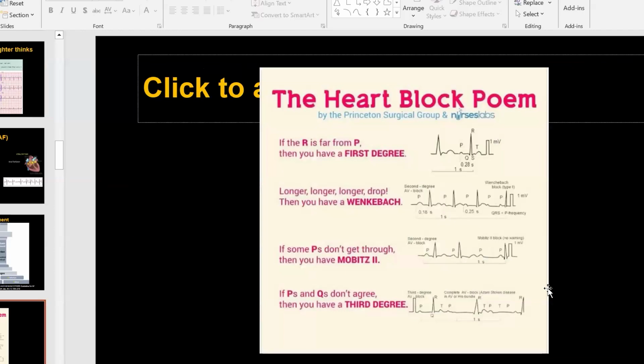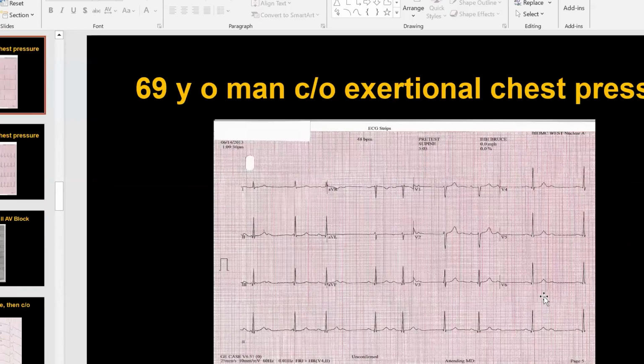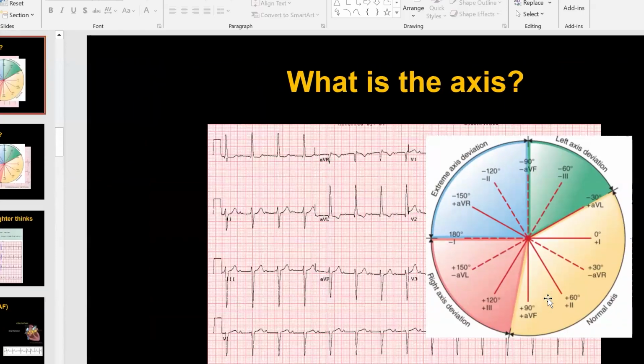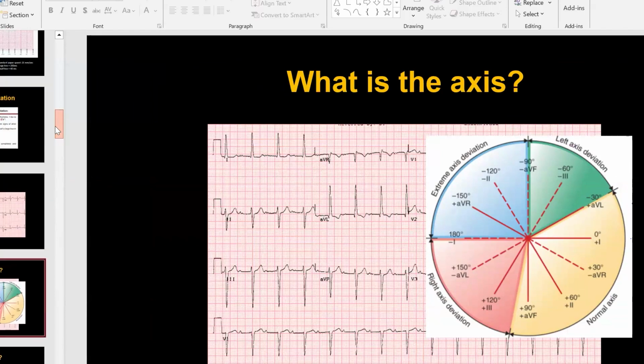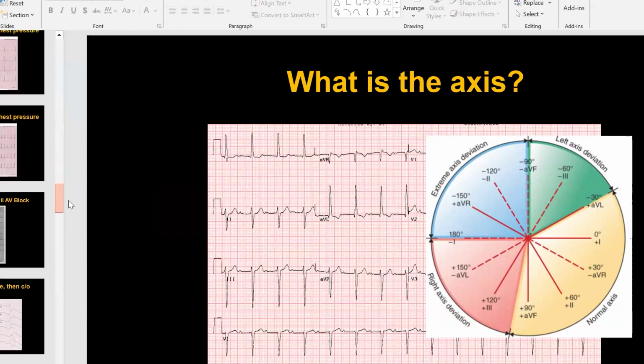No. There was another one where you, yeah, where you were showing rapid AFib and there were ST depressions. in the V2, V3, something like that.